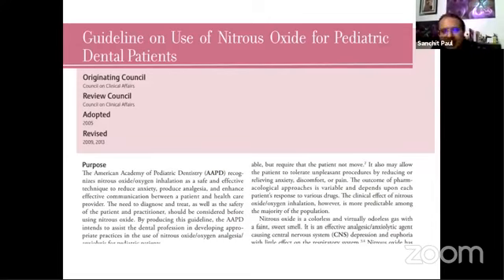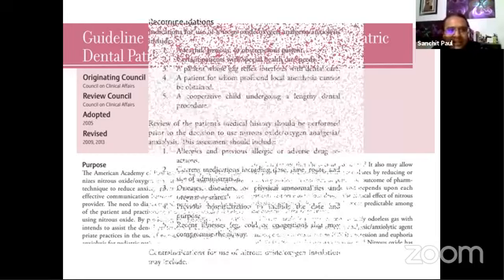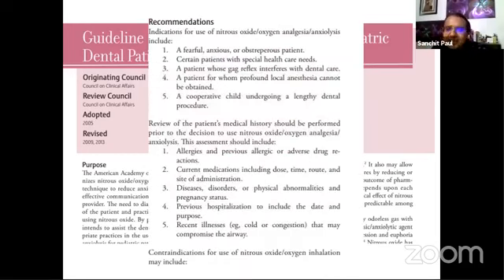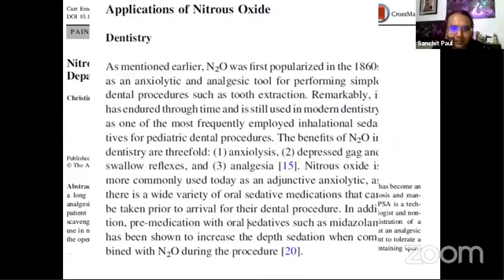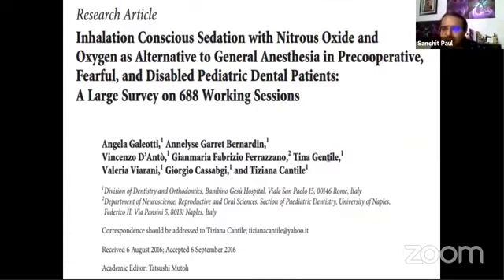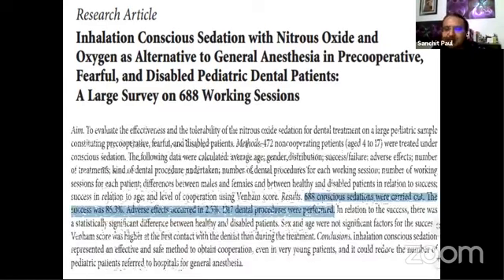Now, there are specific guidelines available all over the literature. These are the AAPD guidelines from 2013, and they clearly mention the protocols to follow in the form of documentation and in carrying out the procedure. Both Dr. Abhishek and I have been doing this centralized nitrous sedation for quite a bit of time now, and we feel that it has substantially reduced the number of cases which we used to do in the operatory.